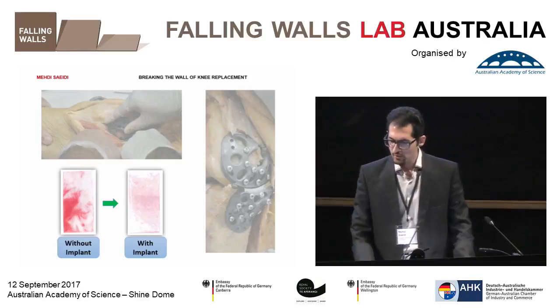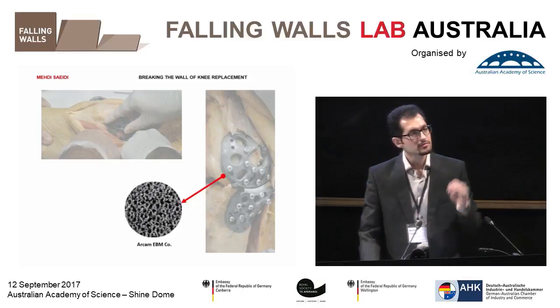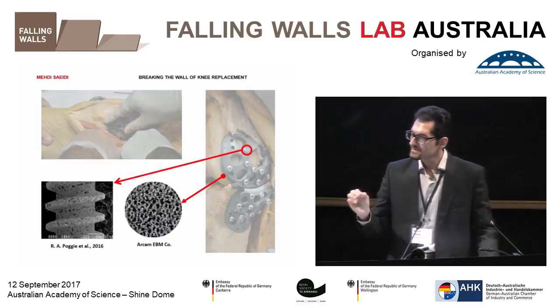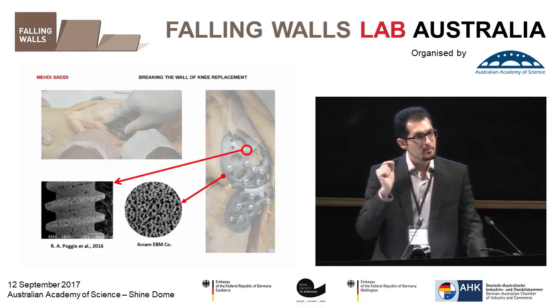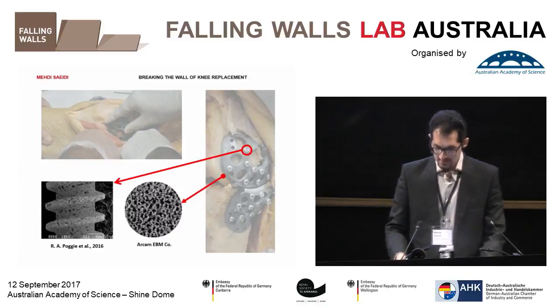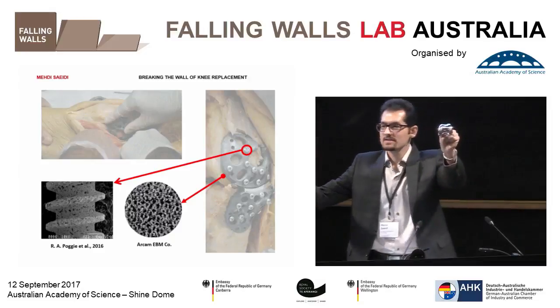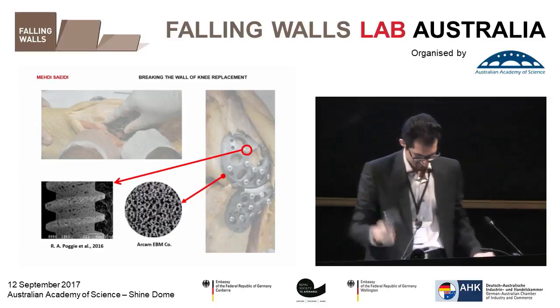To fix the implant to the bone, a lattice structure at the back of the implant and a uniquely designed porous screw with bone ingrowth capability have been considered. To predict and optimize the bone remodeling around the implant, I'm using an advanced technique based on bone cell interaction. Ladies and gentlemen, this is a patented implant, and my hope is that by using it, your need for a knee replacement will be postponed for many years. Thank you all so much.